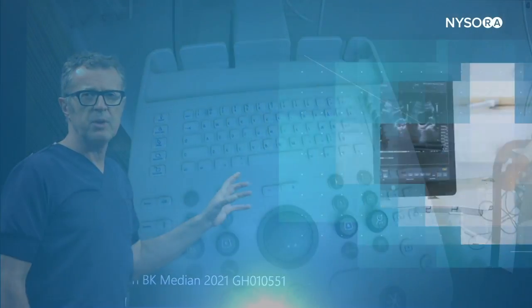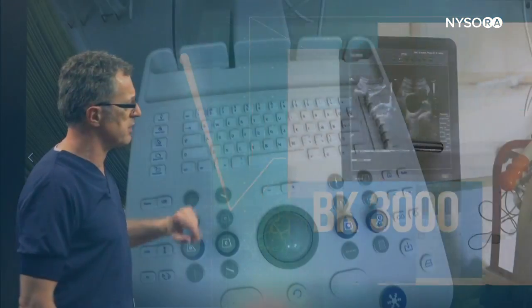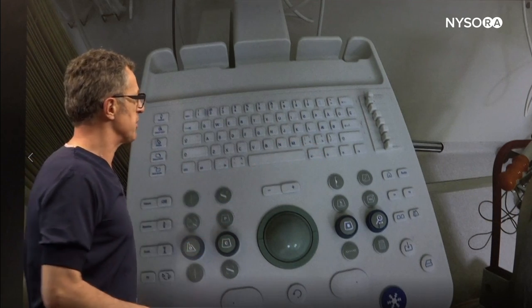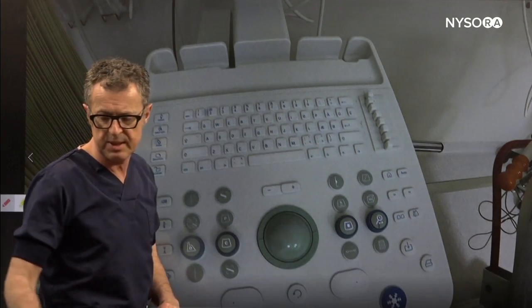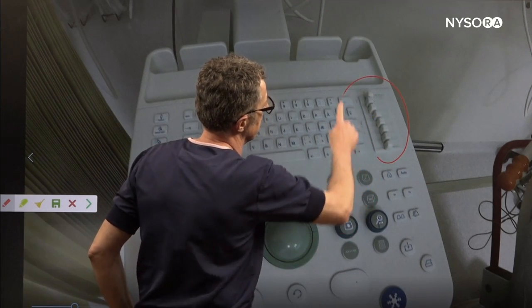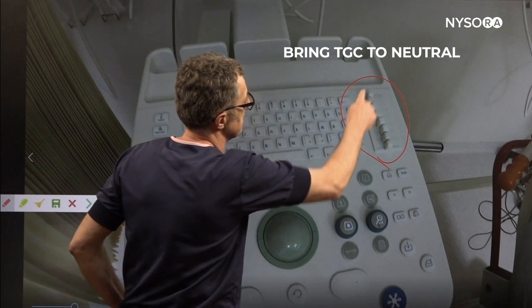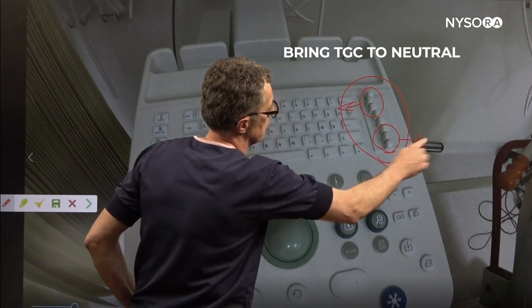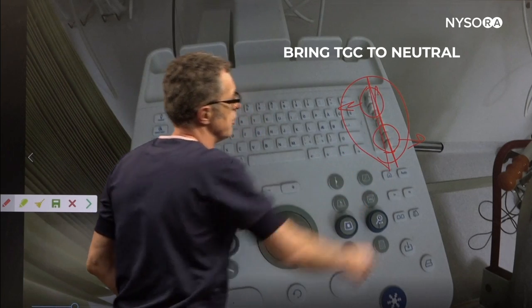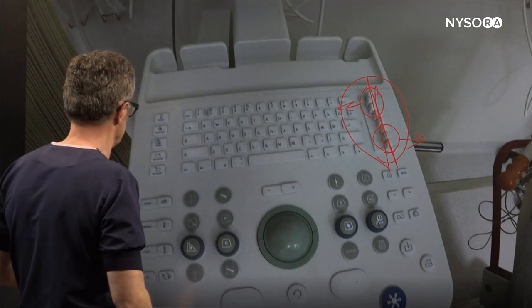This machine over here is the BK3000. It's an older machine and has lots of adjustments. Before you start doing any imaging with the machine you really should take a quick look to see whether somebody before you has tampered with the machine. What I see over here is the time gain compensation control has been played with, and we would like to bring that back to the middle in a neutral position and then adjust it from there accordingly.